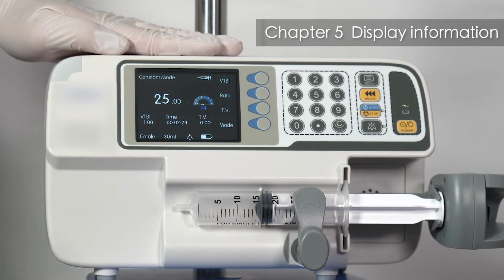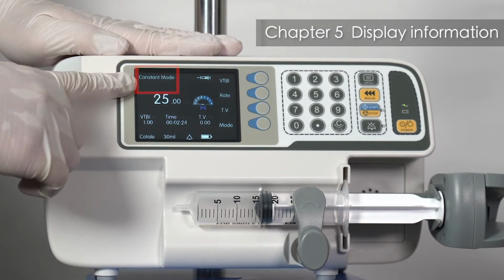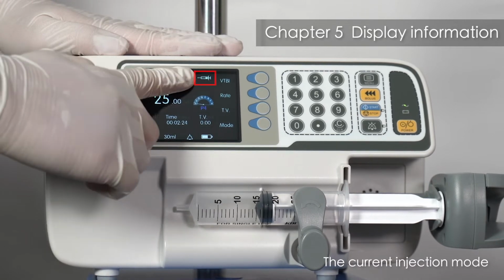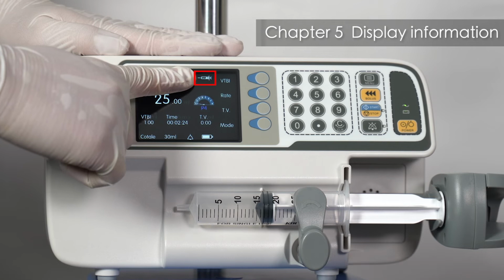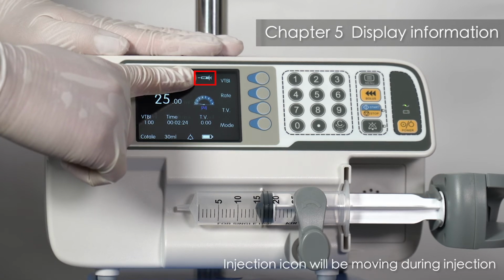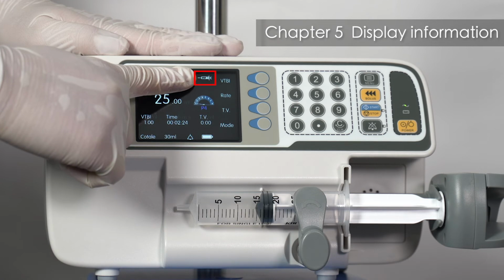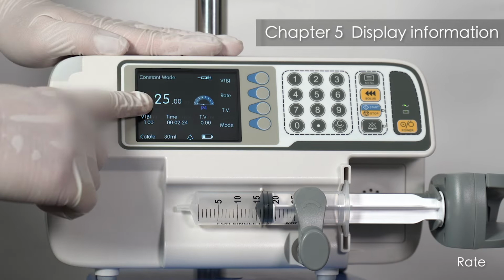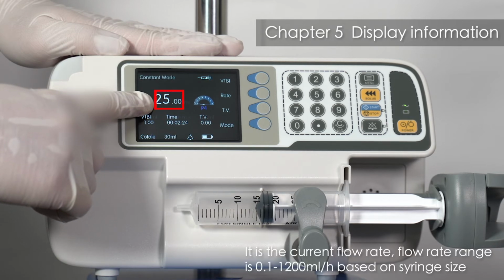Chapter 5. Display Information. Mode. The current injection mode. Injection status. Injection icon will be moving during injection. Injection icon will not move in standby status. Rate. It is the current flow rate. Flow rate range is 0.1 to 1,200 ml per hour based on syringe size.